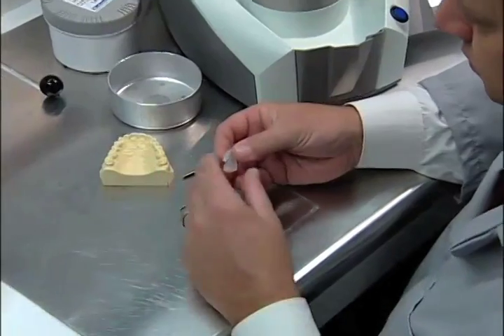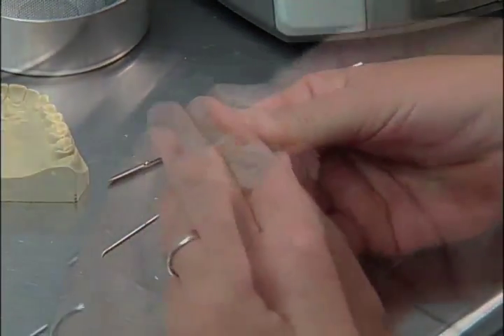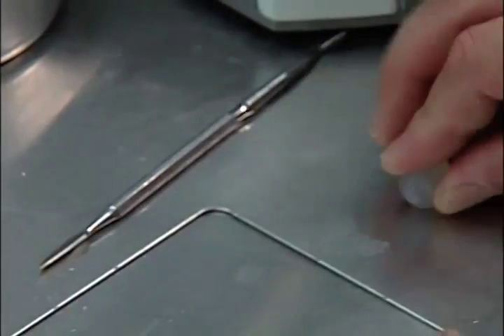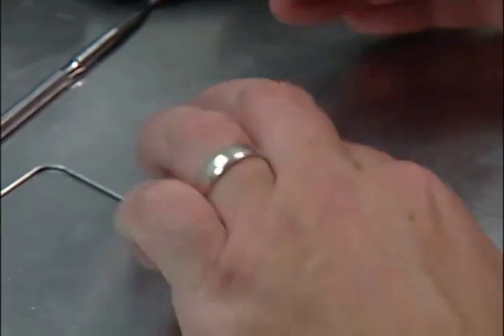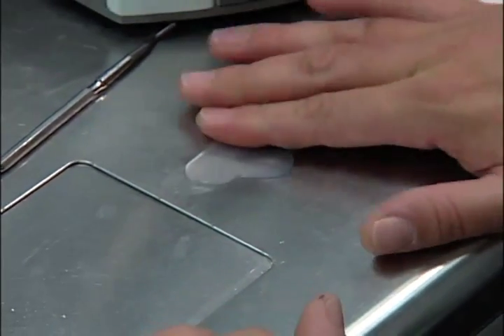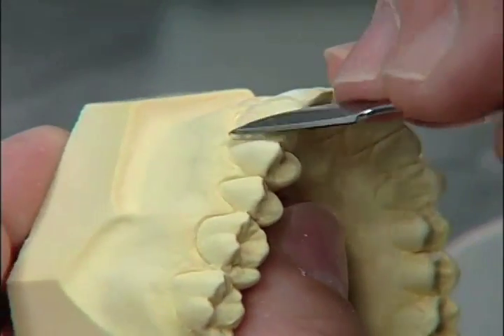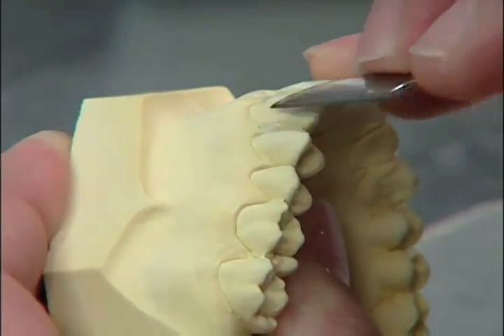Tear off a small piece of ERCOGUM and knead between your fingers. When it is soft and pliable, flatten it on your workbench. Using a waxing tool, pick up a small amount of the ERCOGUM and apply it to the inner proximals of each tooth.